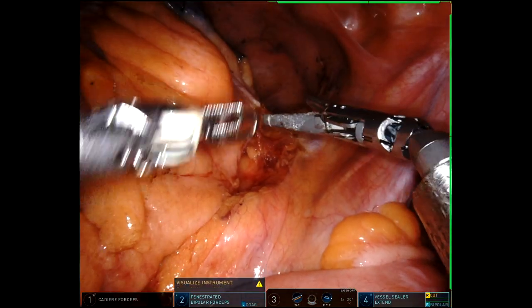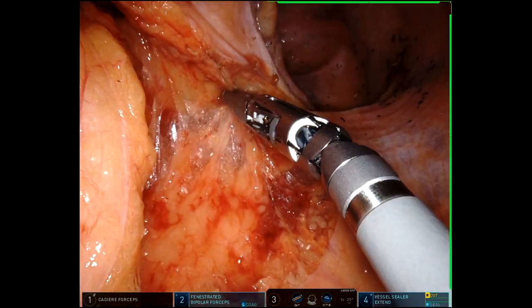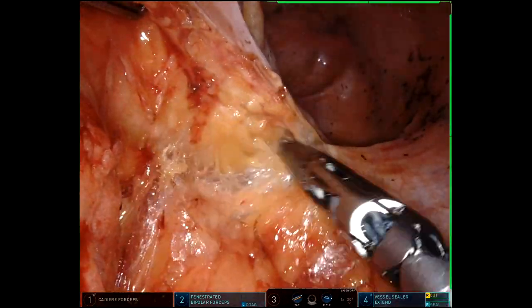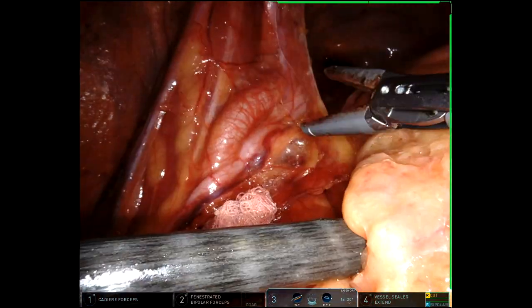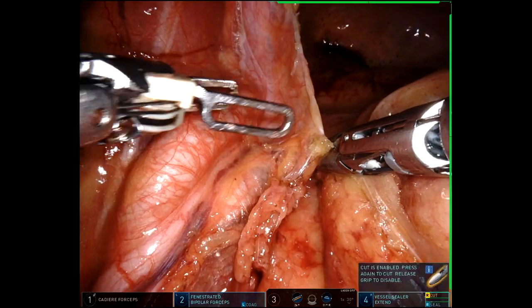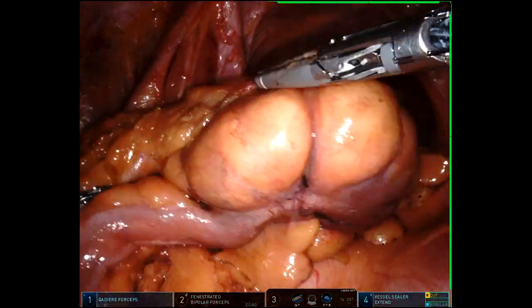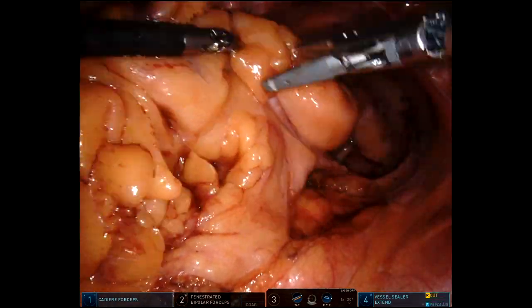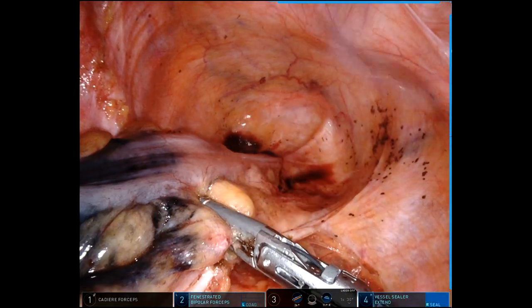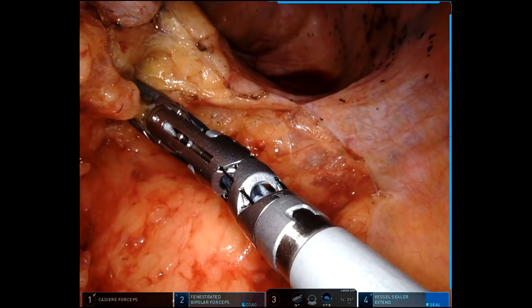That tattoo is about 6 centimeters or more distal to the tumor. There was a comment on the colonoscopy — although when I did a flex sig I didn't see it myself — that there was a separate polyp distal to the cancer, in the vicinity of where the tattoo is. That was not removed because at the time of colonoscopy the patient was on anticoagulation, so I decided I needed to get below the tattoo in order to get that separate polyp out, and that's what I'm doing now by clearing the distal margin.